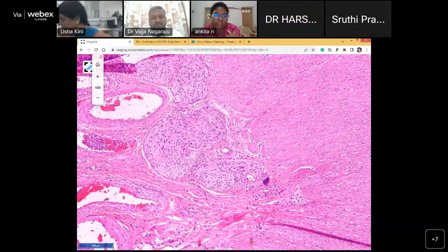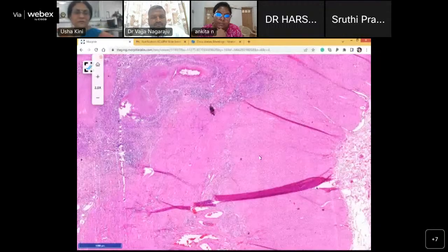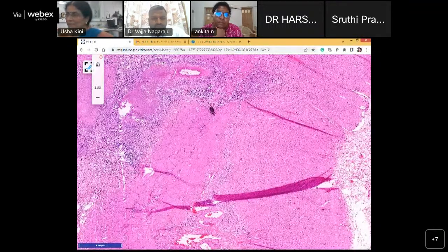So when you find ganglion cells, can this be Hirschsprung's? Near the rectum, absence of ganglion cells is a prominent feature, madam, but ganglion cells will be seen in the normal segments when they have taken the lesion above the obstruction. Okay, so let's come to that part. But I'm more worried about this. I'm worried whether the medium-sized blood vessel there has vasculitis. Why on earth? And that is not one site.